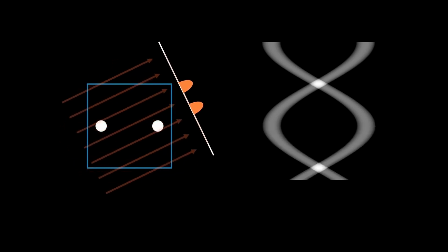Adding a second circle will result in 2 sine curves. Having 2 big circles with different opacities will result in a sinogram where one curve is a bit more opaque than the other one. When the object is not round, the X-ray penetration is not uniform for all angles and therefore the thickness of the curve is varying.